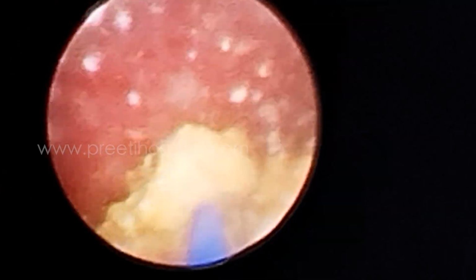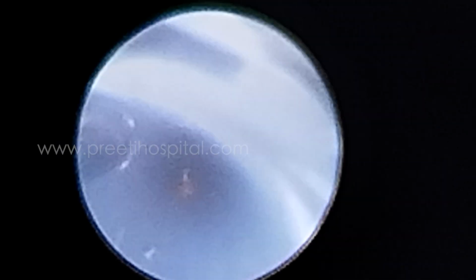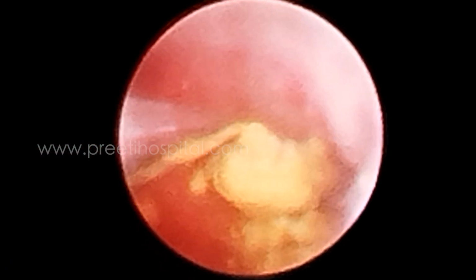See, why is fragmentation not good with thulium fiber laser? Huh? Very good. What is the problem? Flexible nephroscope ready? Forceps. Today I am requiring forceps in supine PCNL mold. No hard and fast rules. So, bleeding absolutely is not there. But tri-prong usage should be careful. Why? One more time you will not be visible, and you will catch the mucosa more. So that is a disadvantage.